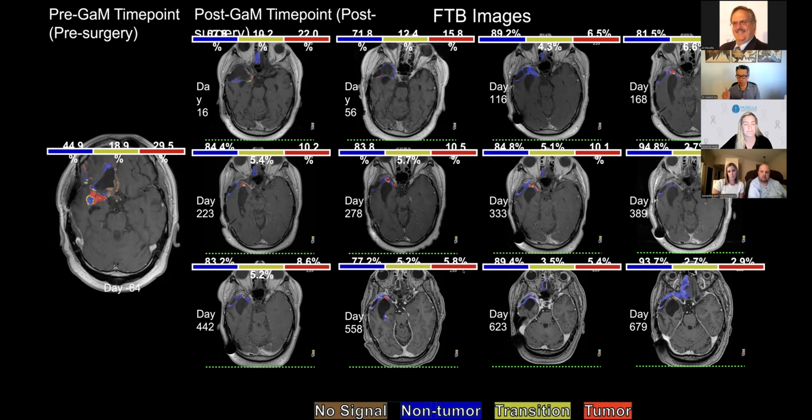So if you just look at that paper and those guidelines, your MR physicist or technologist should be able to basically punch in the right values, cook up the sequence, and be able to acquire it.